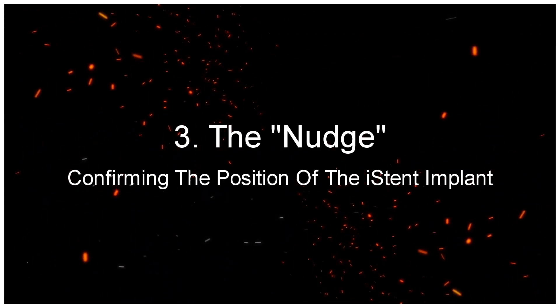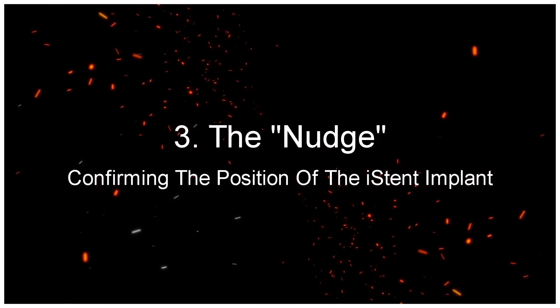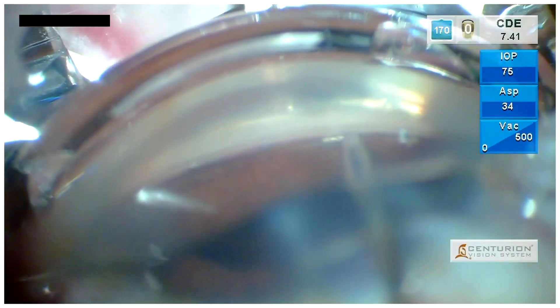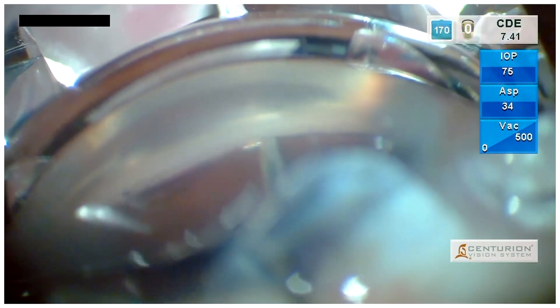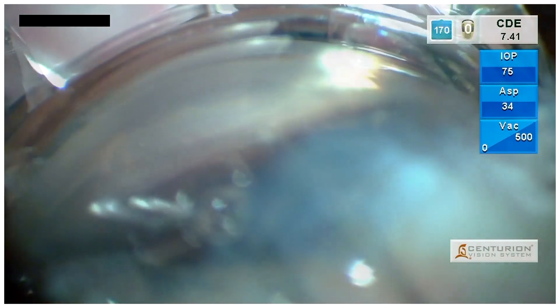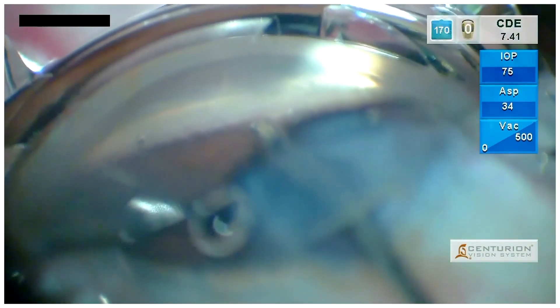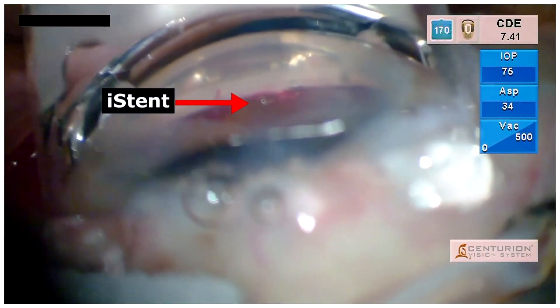The Nudge: confirming the position of the iStent implant. Here we have another case of the G1 iStent being implanted into the angle with a proper gliding technique. Following which, we are not able to identify the positioning of the iStent within the trabecular meshwork, as shown here.